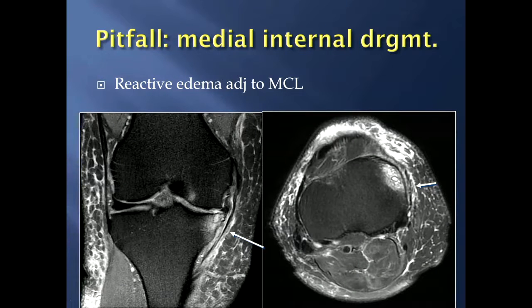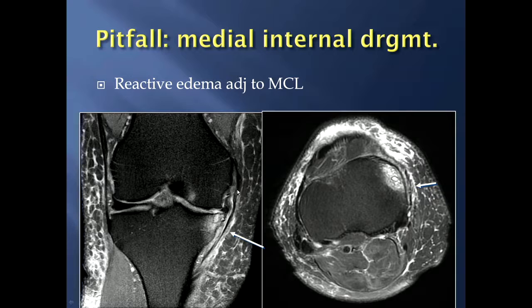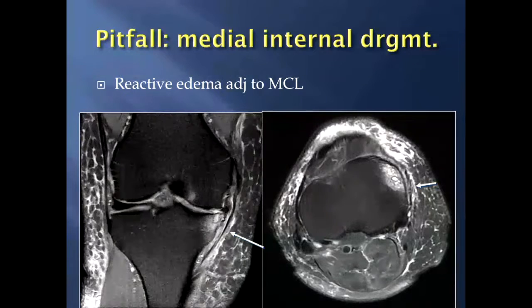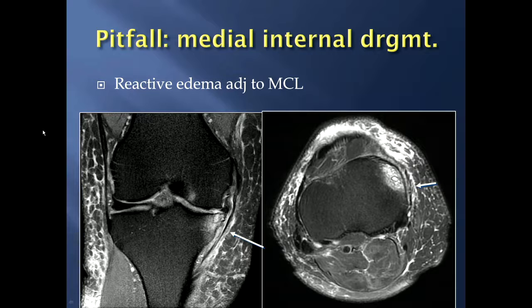There's a pitfall when evaluating the MCL: medial joint internal derangement — such as a meniscal tear or bad osteoarthritis on the medial side — can produce edema around the medial collateral ligament that mimics an MCL sprain. In this patient's case, there was no acute injury, and so this was reactive edema in the setting of medial compartment internal derangement.